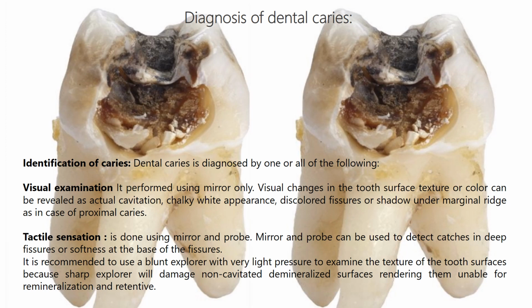Tactile sensation is done using mouth mirror and probe. Mirror and probe can be used to detect catches in deep fissures or softness at the base of the fissures.